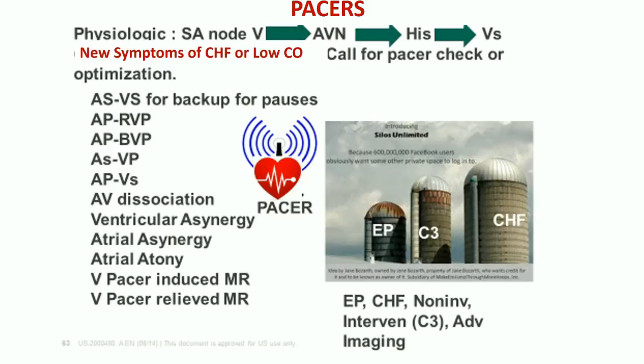And so all kinds of crazy things can happen when you're doing that, and it's not physiologic and it's not needed. So you've got to shut that down to only when it's needed, which means it's on standby and it's an insurance policy. Now we can get atrial pacing, right ventricular pacing. We can get, which is not exactly physiologic either, because where we pace the atrium is not going to be near the sinus node. It's usually in the right atrial appendage. And so in the right atrial appendage, that's not going to be physiologic. That's not very close to the sinus node, but it's a good anchor spot. So the right atrium is going to be squeezing funny.